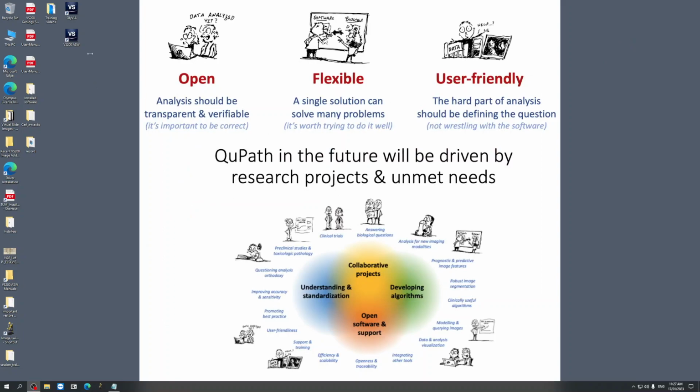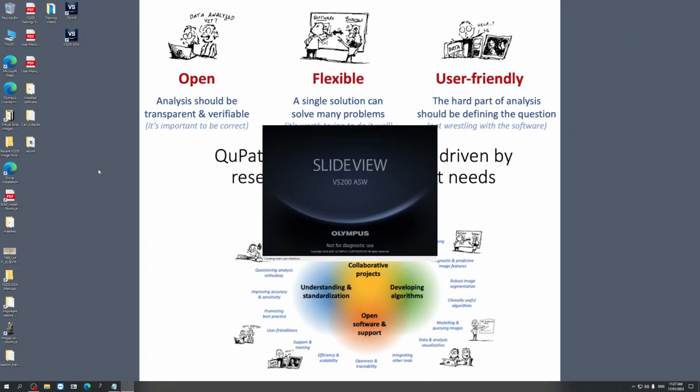So we open ASW software. At the moment, we have the computer, the microscope, and the reflected light lamp switched on. Therefore, we are good to go. We will do acquisition in 2 different magnifications. The first one is 4x and the second is 10x. 4x is going to be very quick, so that will give us some time to explain some of the things that you can be playing with during your session in the software.